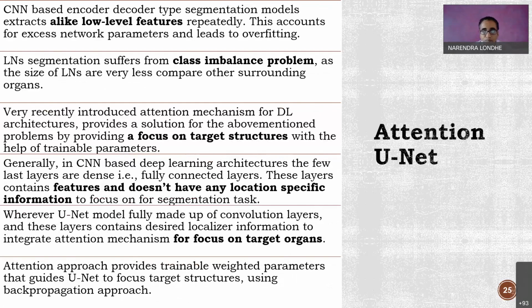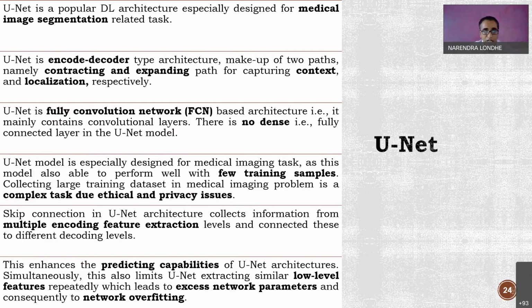So that is what exactly is there. Encoding is there, as well as decoding, or I can alternatively say a contracting path and an expanding path, right? For capturing the context and the localization. So that is what is involved.